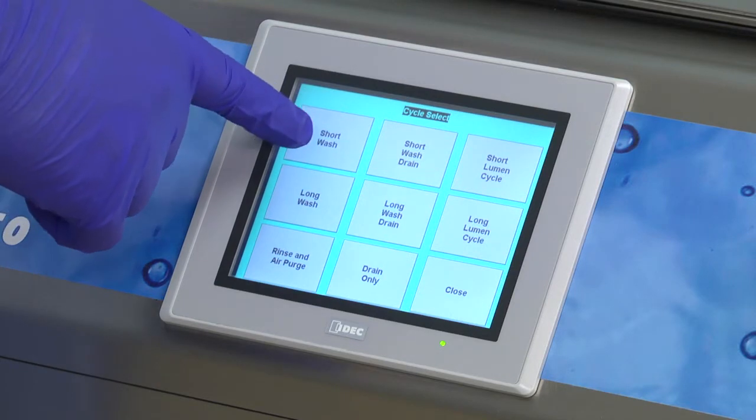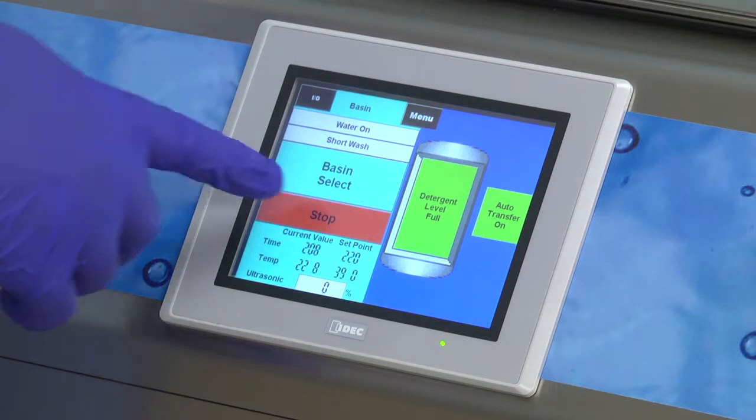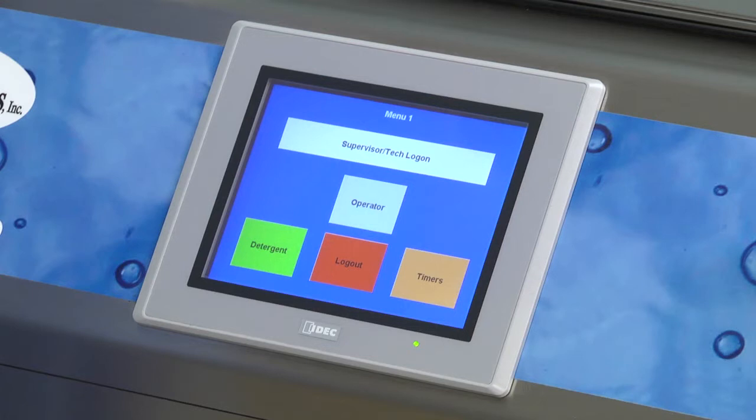Once you begin a cycle, a countdown timer updates you on the amount of time left in a cycle. If you need to abort a cycle for any reason, simply press the Stop button. Operators should log out of the system after their cycle has finished running. To do this, simply press Log Out from Menu 1.